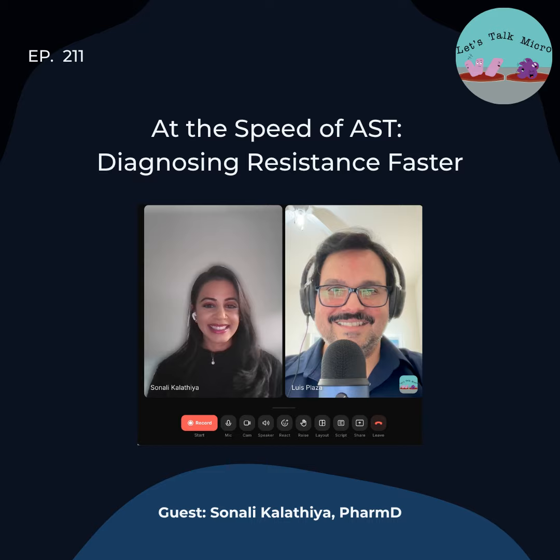Yes, and for some of the most common organisms that you see in blood cultures, there are many instruments out there, from many different manufacturers, where you run that blood culture and you get that ID. But if it's not there on the targets, then you have to find another way to give that ID, right? So okay, and then how does this technology achieve those faster turnaround times?